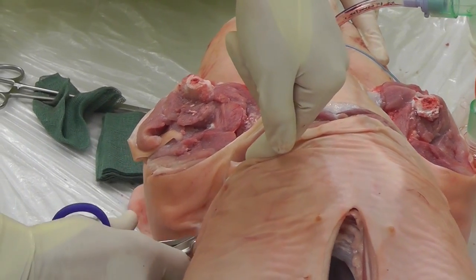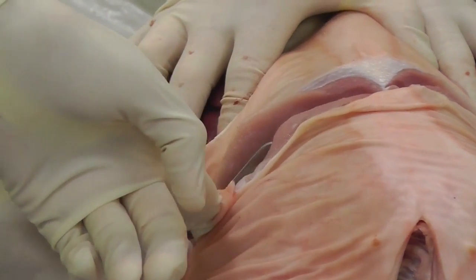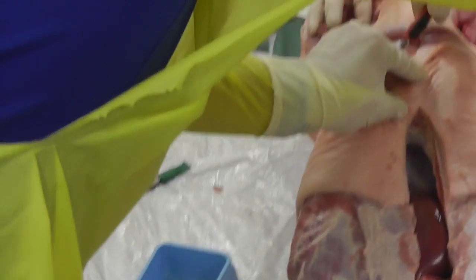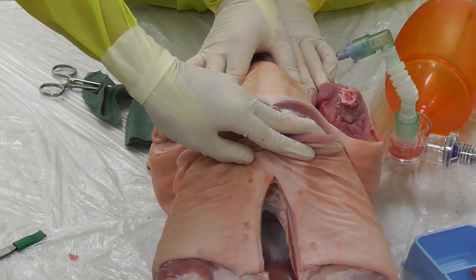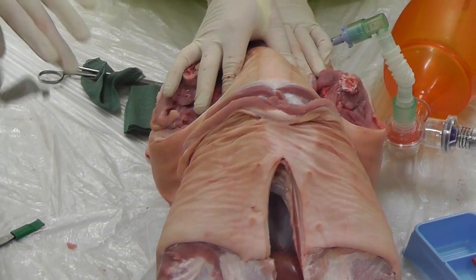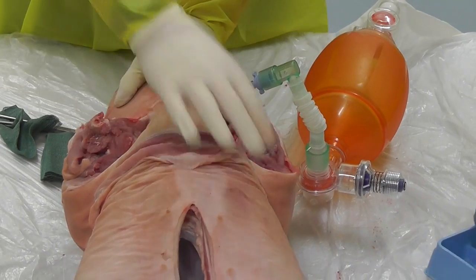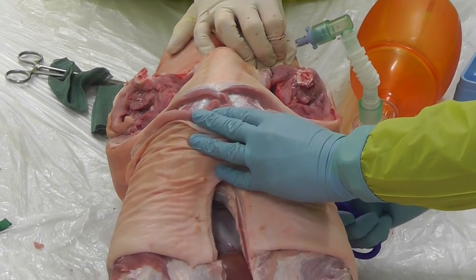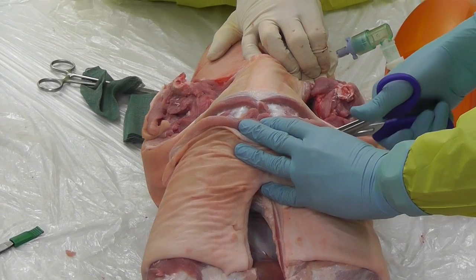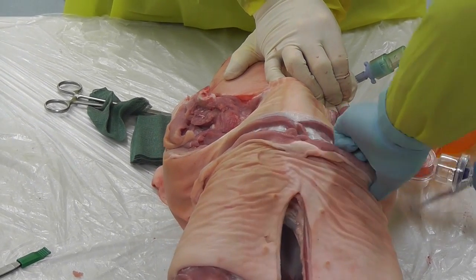You are going to cut the intercostal muscles — try and follow the muscles rather than accidentally cutting the ribs, because it can be easier to gain purchase on that bone. Go up to sternum. If your incision is not exactly right, you might need to extend it. If you are coming up to sternum and there is skin over it, divide that through here. Go up to sternum and pass the trauma shears to your mate on the other side. You are probably not going to get through the sternum on the pig model — the quadruped sternum is much more rigid.